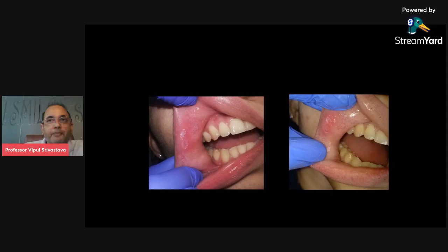The process is called laser bandage, and in my third webinar, introducing laser for day-to-day practice, I will be discussing this in more detail. For the time being, just remember, I am typing here in the chat box, laser bandage. This is the technique known as laser bandage, which we use for treatment of ulcers.